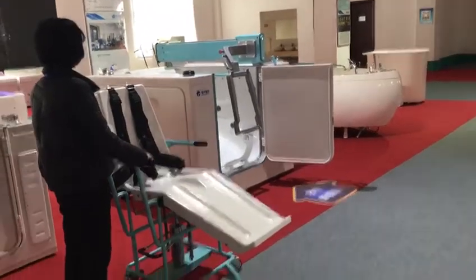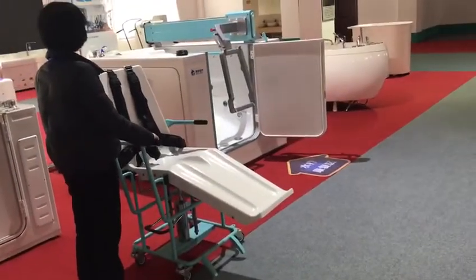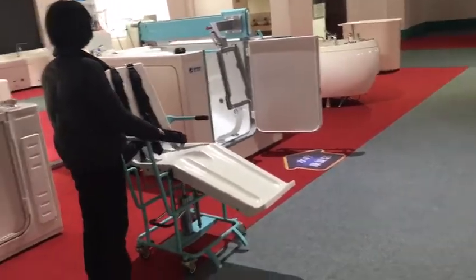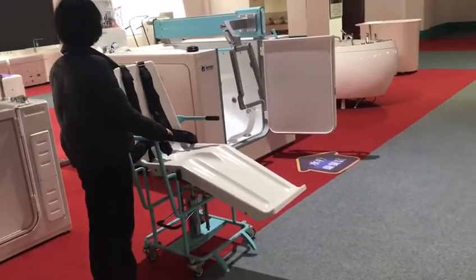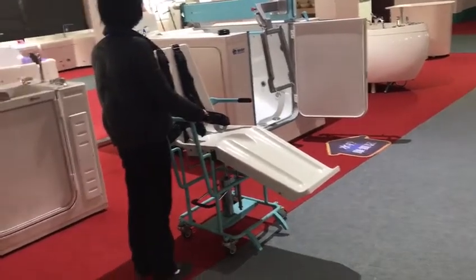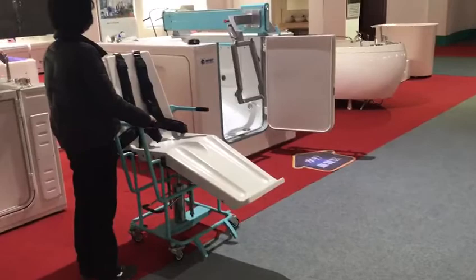This device is special for patients to go for a shower, no matter if the patient is on the bed or not. If the patient can't walk, there is also a trolley to transfer the patient from the bed.